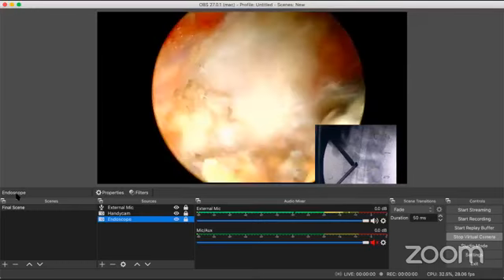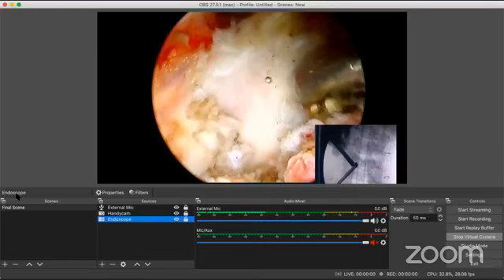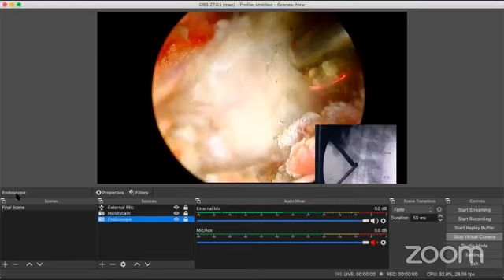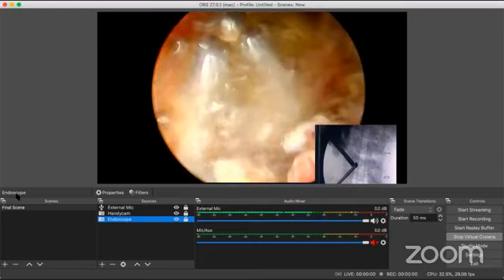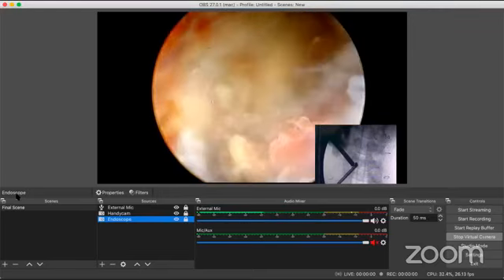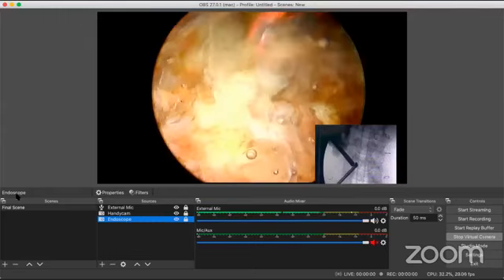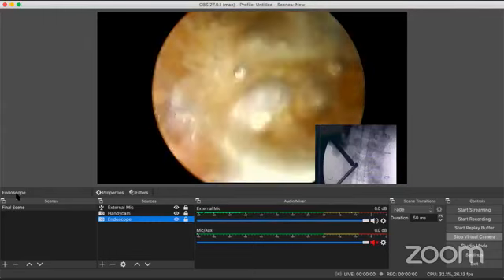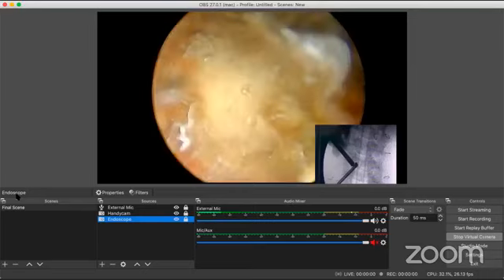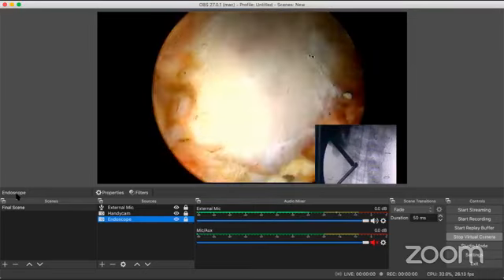One minute, please hold your position. Okay, fire, please. Okay, lower lamina bone being stripped away. I really need to go laterally. Okay, stop, please. Thank you.